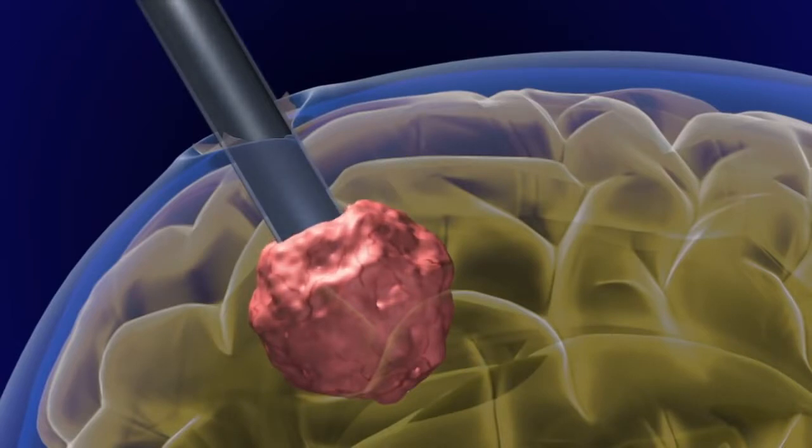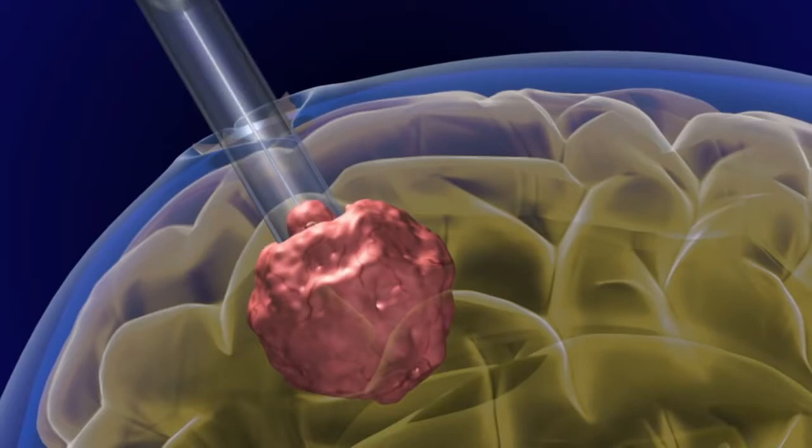As the port is inserted, no normal brain tissue is removed, and no other retractors on the brain are needed. This minimizes any damage to the normal structures of the brain.